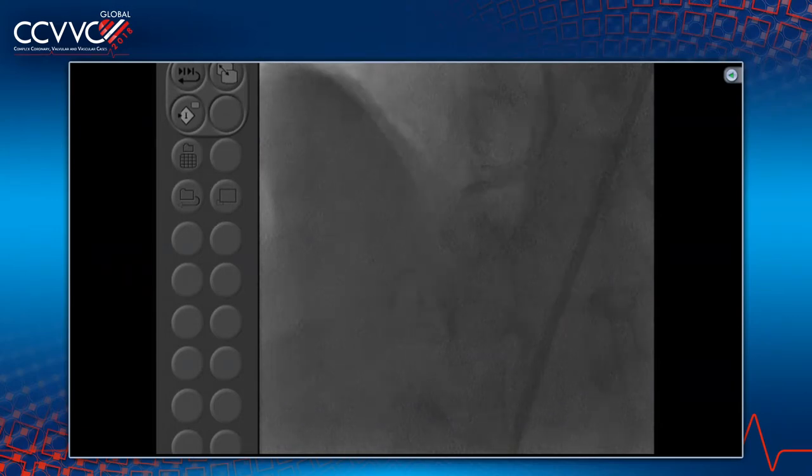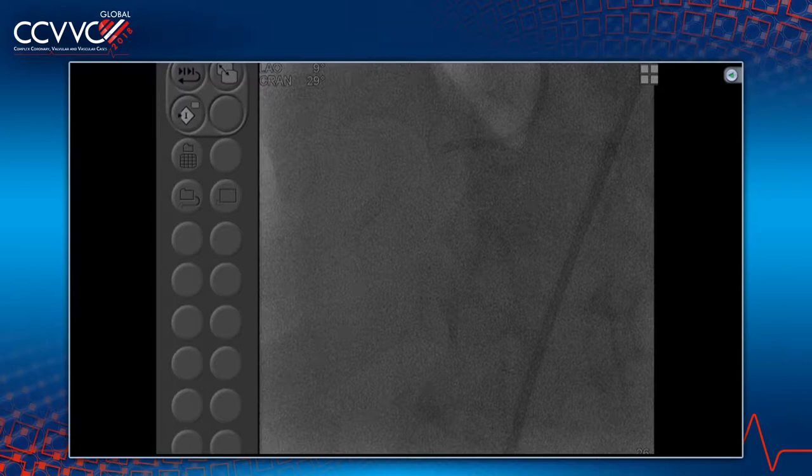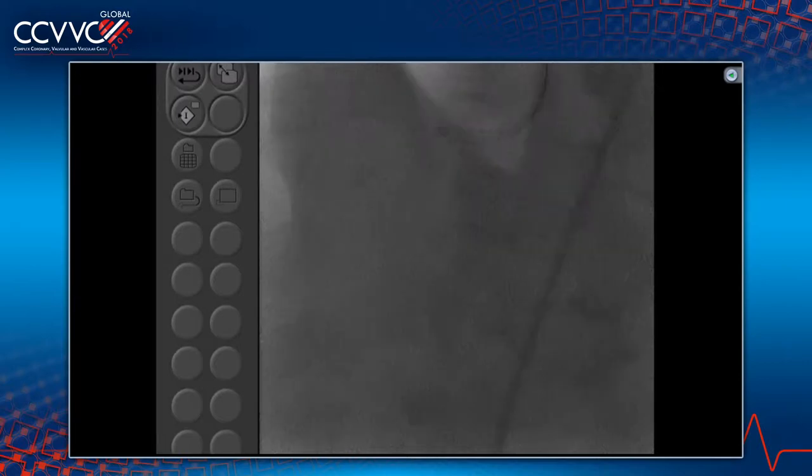Do you usually go to Gaia 3 right away? Yeah, Gaia 3 or Miracle Bros, one of the two. And which microcatheter do you have? Right now we have Fine Cross. Any particular preference in microcatheter selection? Once the first wire, which is the soft wire, is not crossing, mostly for me it is Gaia Second, which I will take as the first, and then escalate to Gaia Third. Why do you think that? Because Gaia Second is less traumatic. It is not so stiff. Already crossed. Yeah. Well, let's see.